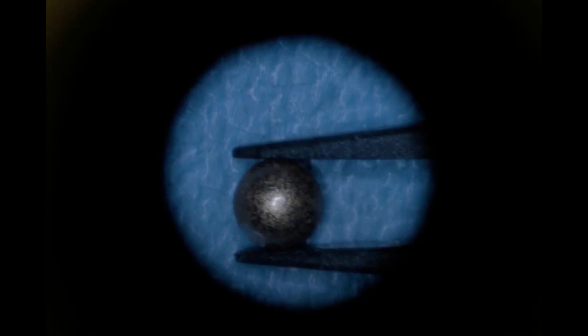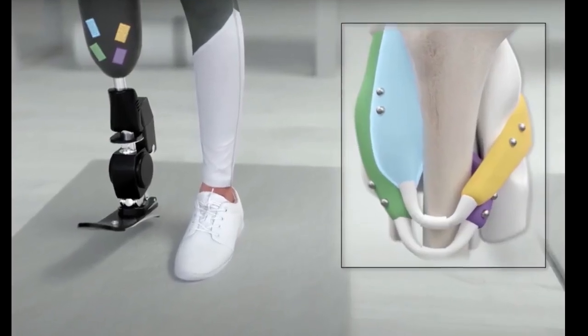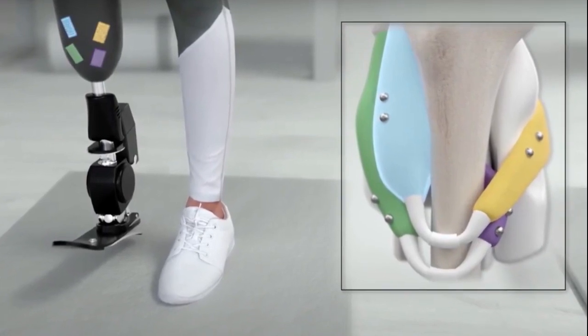In a study published last year, the researchers showed that this system could be used to accurately measure small angle movements when the beads were implanted in the calf muscles of turkeys. In one of the new studies, the researchers set out to see if the system could make accurate measurements during more natural movements in a non-laboratory setting. To do that, they created an obstacle course of ramps for the turkeys to climb and boxes for them to jump on and off of. The researchers used their magnetic sensor to track muscle movements during these activities and found that the system could calculate muscle lengths in less than a millisecond.